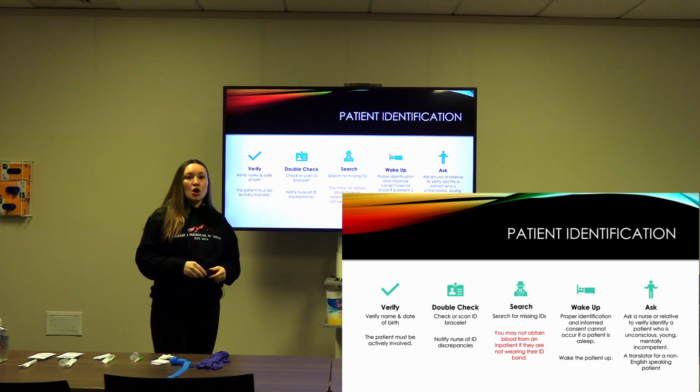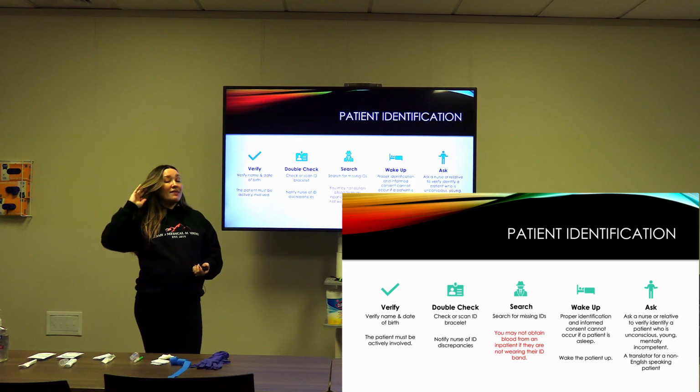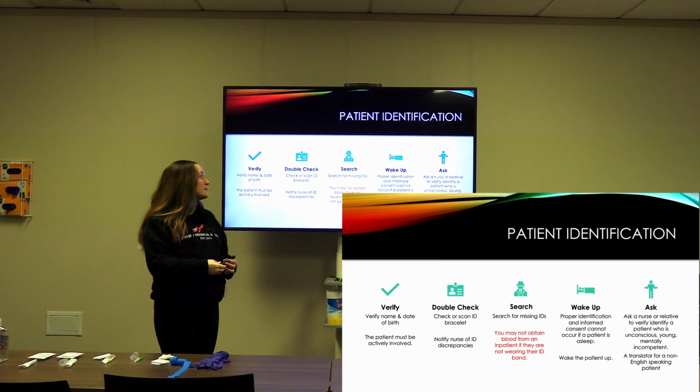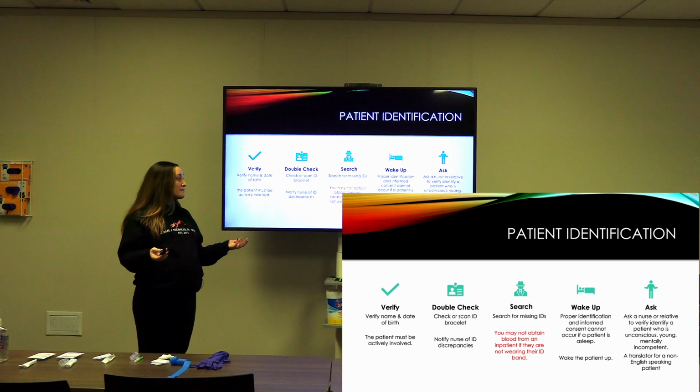Come in nice and quietly, wake them up gently, apologize for waking them up, and then obtain consent, and then identify the patient. Proper identification and informed consent cannot occur if a patient is asleep, and so we need to do our best to wake every single patient up.